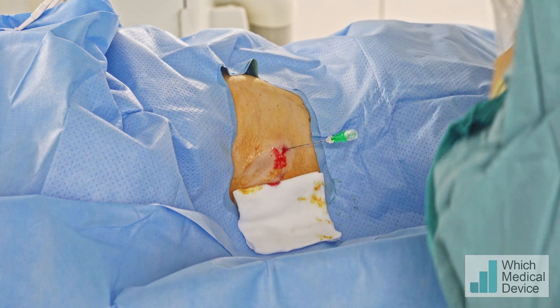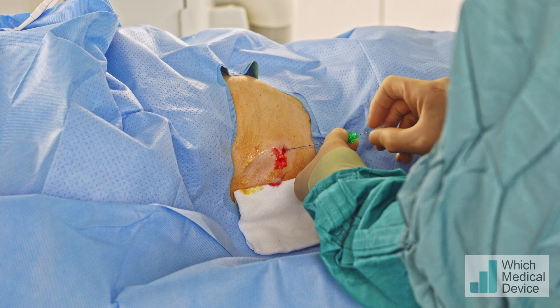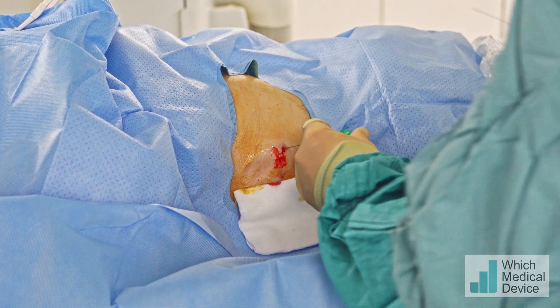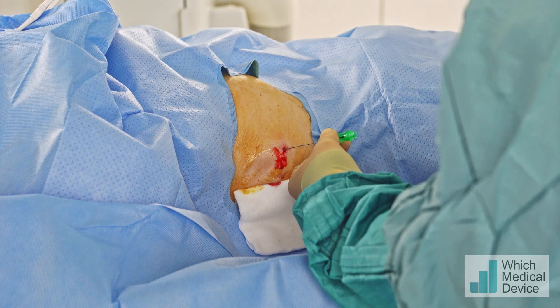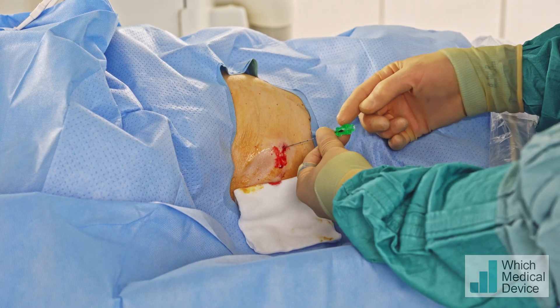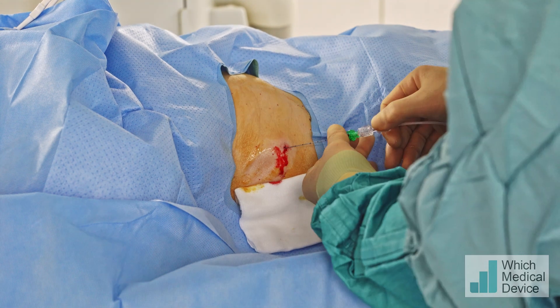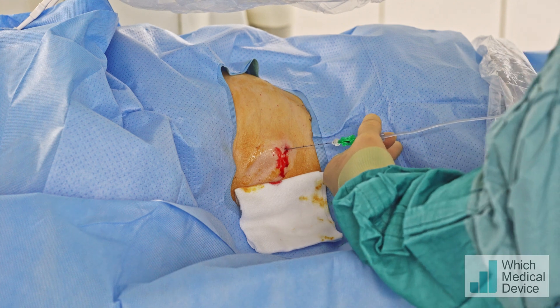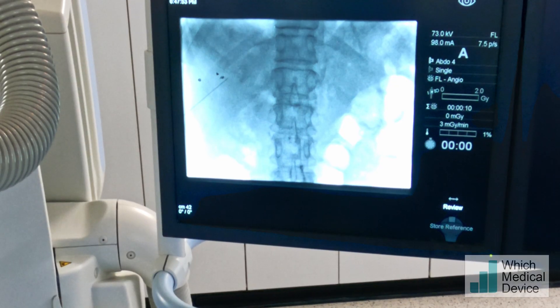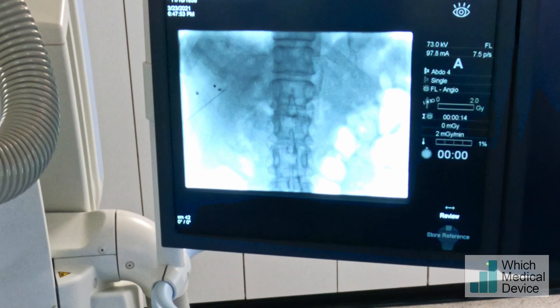I'm going to put the ultrasound down and take the central bit out. We'll need to check with some contrast that we're in the right place. I can see I'm actually getting blood back through that needle now, so we're certainly in a vascular structure. We'll just screen the tip of the needle — contrast going in — and that looks to be portal vein.